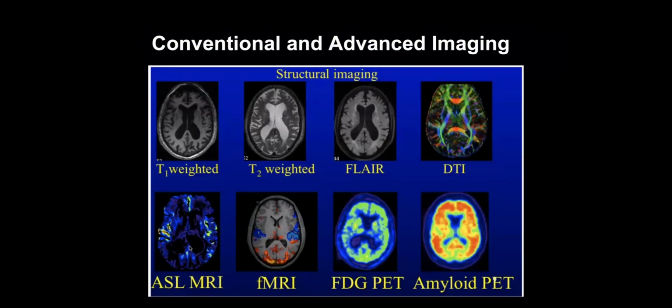And of course, conventional and advanced imaging entails a variety of techniques. Conventional sequences tend to be revolving around different types of weighting. So there's T1 signal that emphasizes brain structure. There's T2 signal that looks more at white matter and fluid signal. Those are conventional sequences. Fluid attenuated inversion recovery is an example of that type of weighting on the T2. And of course, as you move from those conventional sequences to diffusion tensor imaging or DTI, we can start looking at the neural wiring of the brain. We can look at arterial spin labeled or ASL MRI to look at blood flow.